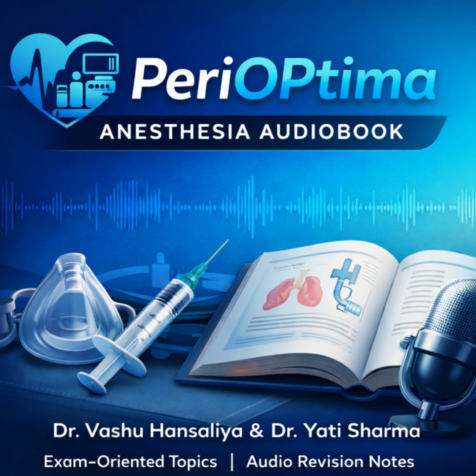It's a decelerating ramp. Gas rushes in really fast at the beginning to hit that pressure target, and then the flow naturally tapers off as the lung fills up. And the cycling mechanism is time. It's time cycled. The breath ends when the set inspiratory time, that 1 second, is up. Simple as that. So the big advantage here is safety. You're controlling the pressure. Exactly. You are directly limiting the peak airway pressure, so your risk of barotrauma is much, much lower. Plus, a lot of physiologists argue that decelerating flow pattern is better for gas distribution in stiff lungs, so you might get better oxygenation.